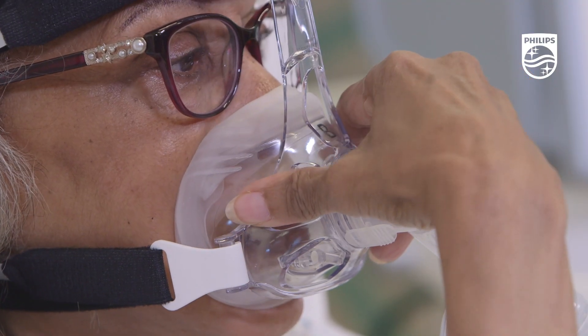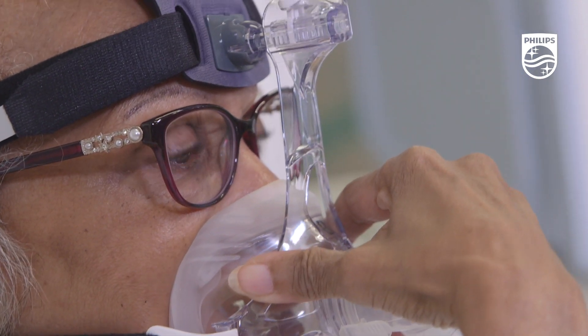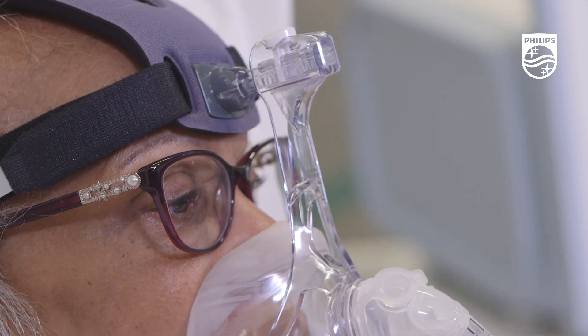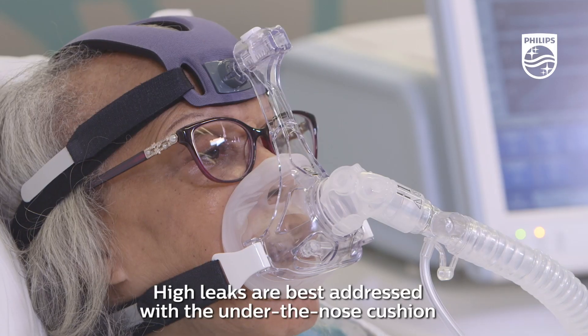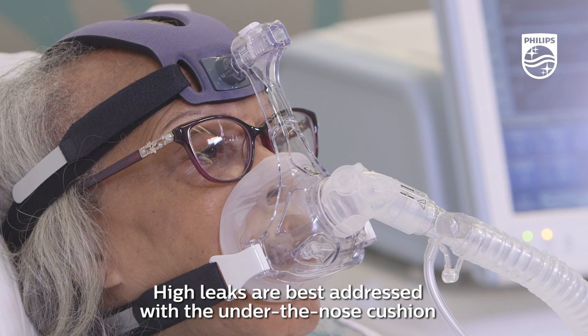Leaks at the sides of the mask may be addressed by adjusting the mask angle using the ball and socket or lower straps, but high leaks in this area may be best addressed using the under-the-nose cushion.